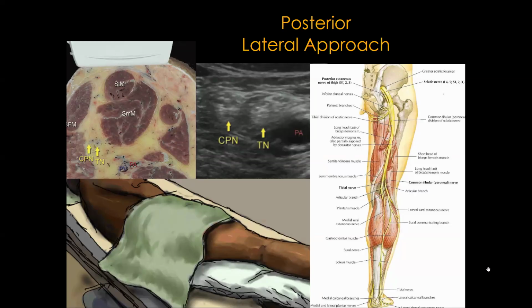So I always grab like 2 towels, fold them up, scan my dominant hand, put my hand on the towels, and now I have a nice firm fulcrum to prevent myself from moving.